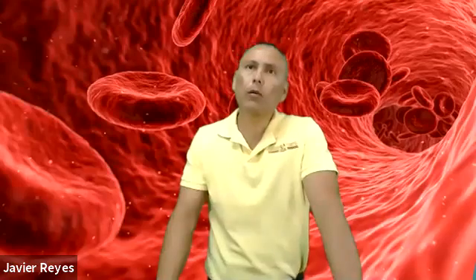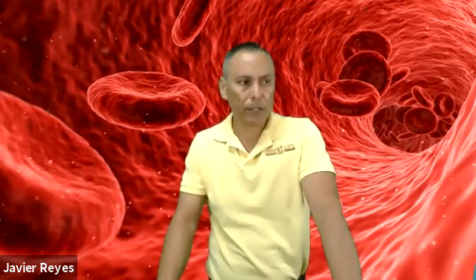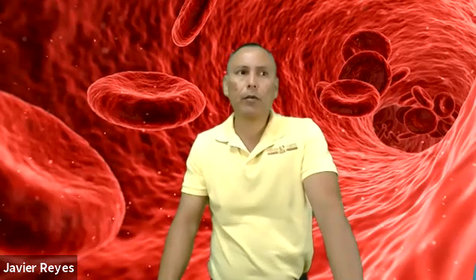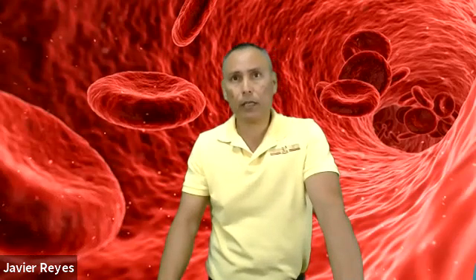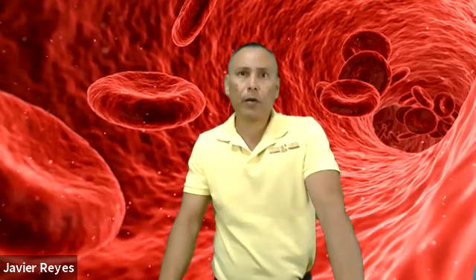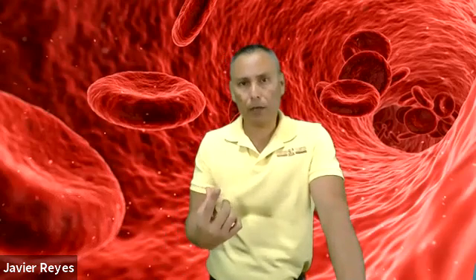Sometimes your blood flow will stop. It will come to a complete stop. Okay, why? Because the vein collapses. When do they collapse? Remember that you're going to select the equipment necessary, depending on the condition of the vein and the patient. So if you have a weak, dehydrated patient, the veins are going to collapse because of the vacuum.